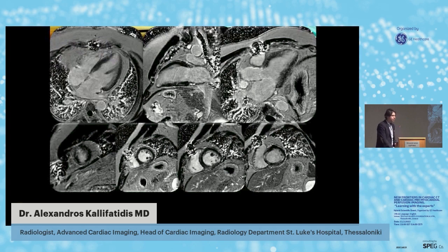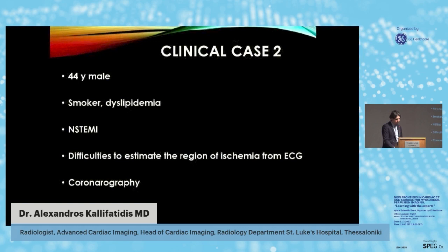Thank you so much. You can find much more information on the site of Circle about this project. And just to show you finally from the previous patient the late enhancement sequences, another useful technique, we can see even small infarcted areas here not known till the examination for this patient, and for sure very difficult to see these small infarctions with SPECT.